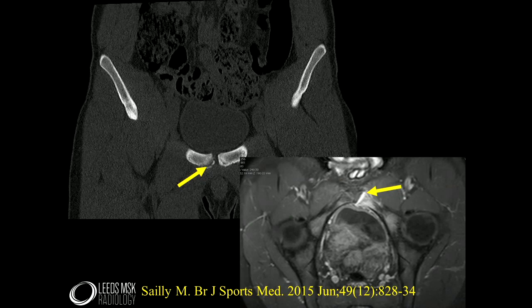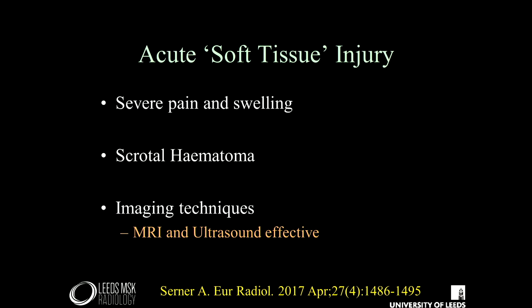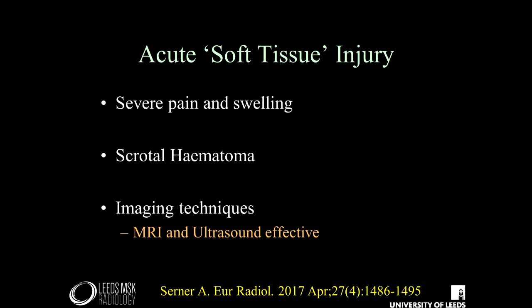Acute soft tissue injury is usually in the athletic population and can cause severe pain and swelling. Because of the complexity of the anatomical location with the inguinal canal, scrotum, and other areas, you can get discharge of hemorrhage throughout that region — so it can be quite alarming with a large scrotal hematoma. You can diagnose acute tearing with MRI and ultrasound, but often with the complexity of the soft tissues, MRI is usually easier to get a global overview. There's a recent reference from 2017 for further reading.